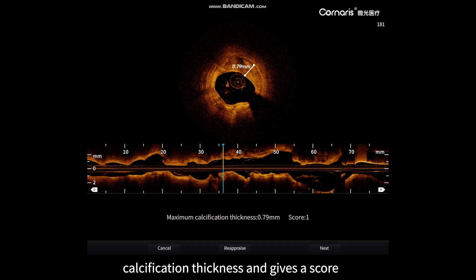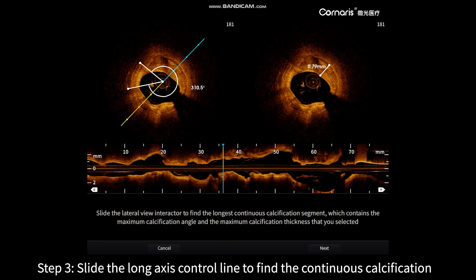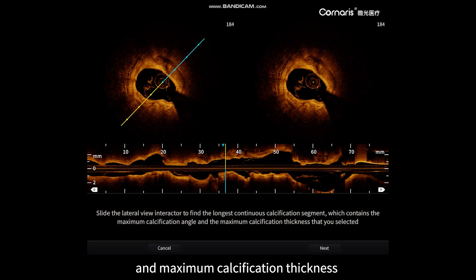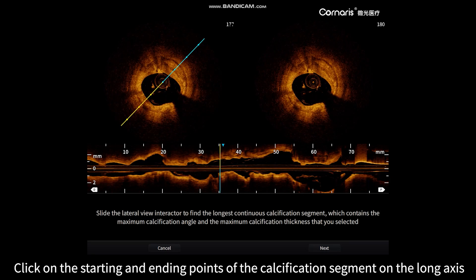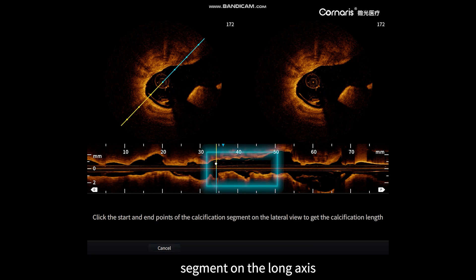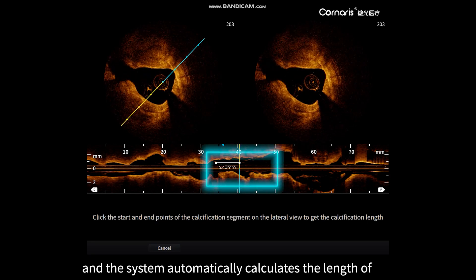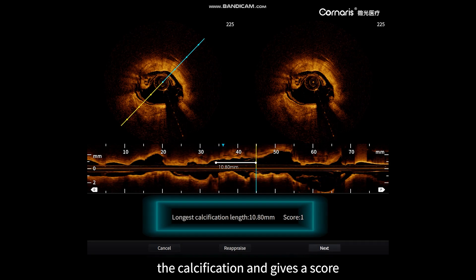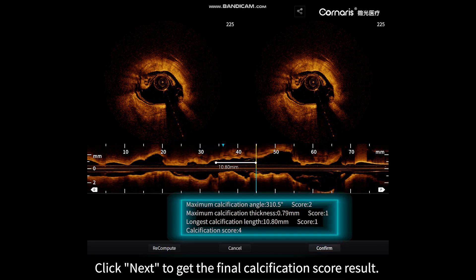Step three: slide the long axis control line to find the continuous calcification segment that includes the maximum calcification angle and maximum calcification thickness. Click on the starting and ending points of the calcification segment on the long axis and the system automatically calculates the length of the calcification and gives a score. Click Next to get the final calcification score result.